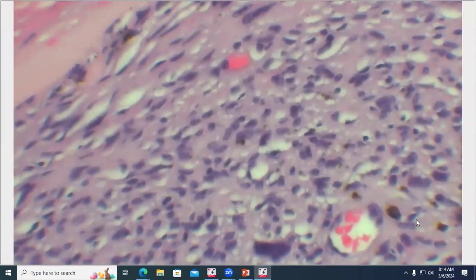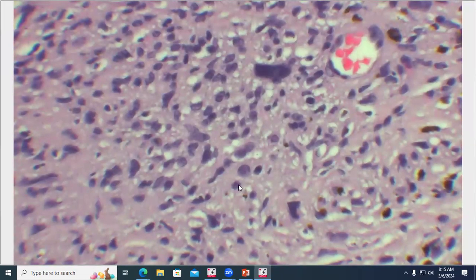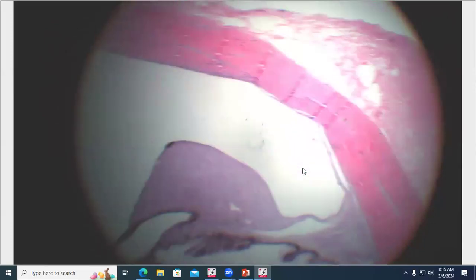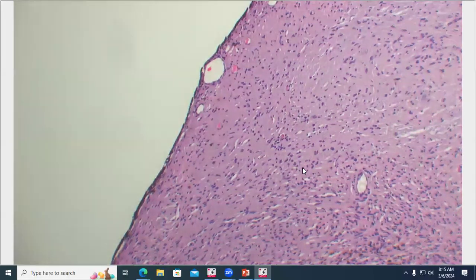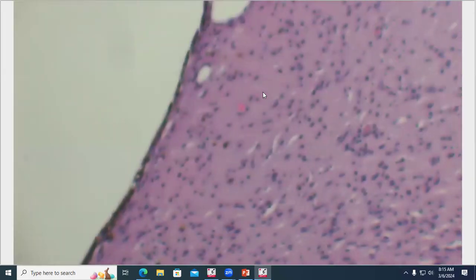So we have a population of atypical spindle cells. They have indistinct cell borders. They're sort of haphazardly arranged. There's quite a variation in nuclear size. So you can see this gigantic nucleus down here. Here's one with a big old nucleolus. Mitotic figures are pretty rare. But we've got a neoplastic population here. And actually, I'm going to zip back to the gonio slice because we have a little bit more cells to look at in this one. And we can also more easily appreciate the ectropion uveae, where the iris epithelium is being pulled around to the front. So here are more of those cells.